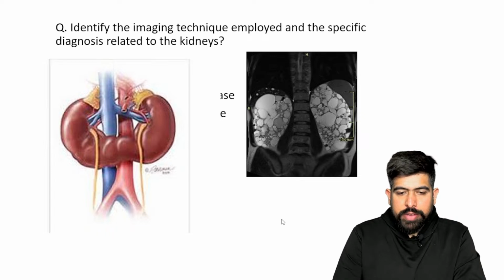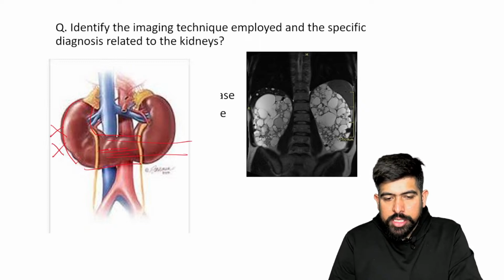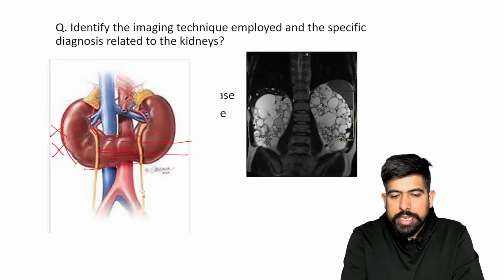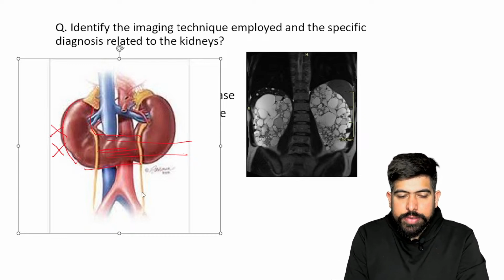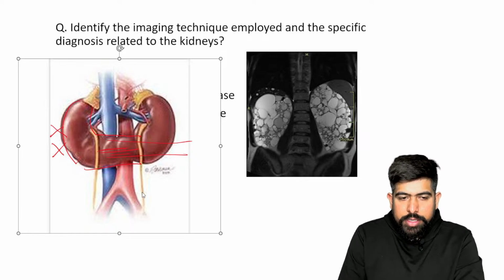Just check it out, then we'll remove it. Both of the kidneys are there, and this is making an attachment. Can you see? Both are attached here. Does it seem that the kidneys are attached here? Yes or no? Not possible.